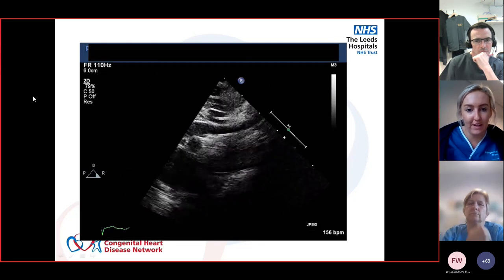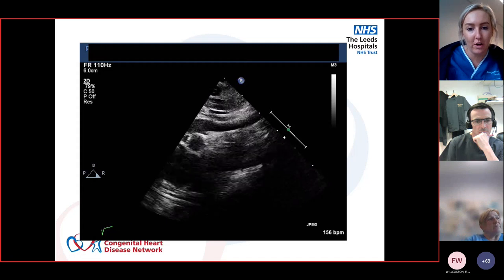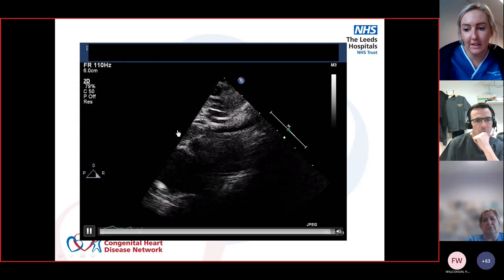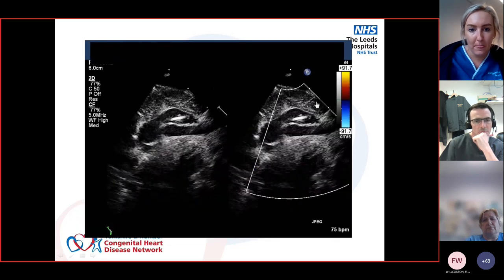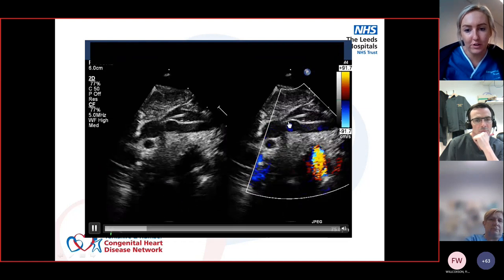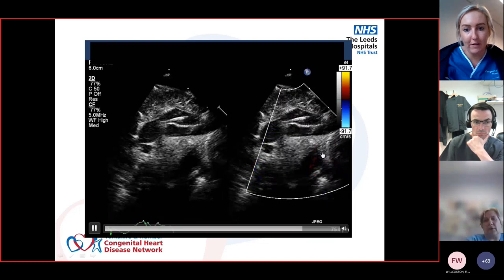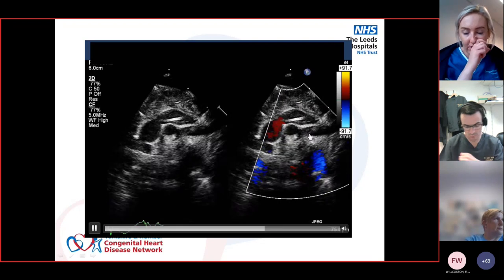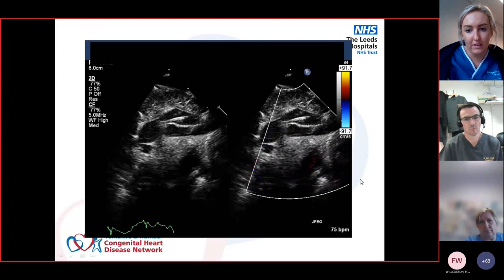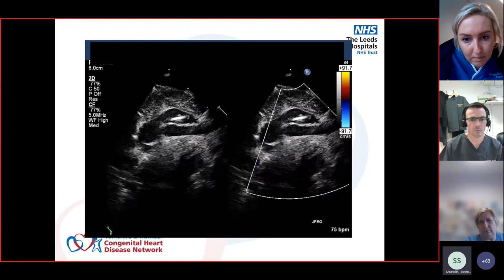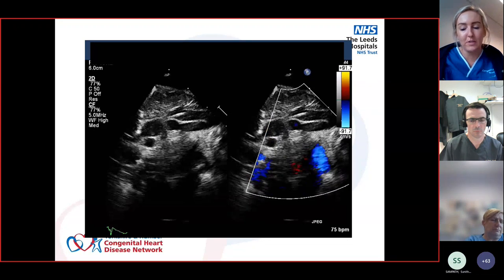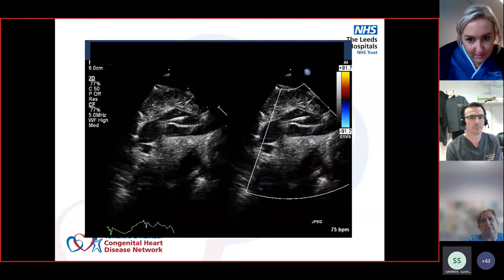The suprasternal view confirms: the head and neck vessel doesn't join the descending aorta - it goes only to the ascending and head. Further shots show the duct further down and the second head and neck vessel not joining it. Getting the suprasternal view is important to properly visualise head and neck vessels and confirm true arch versus ductal arch.